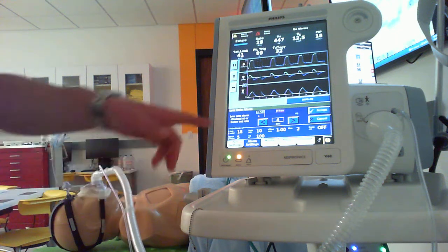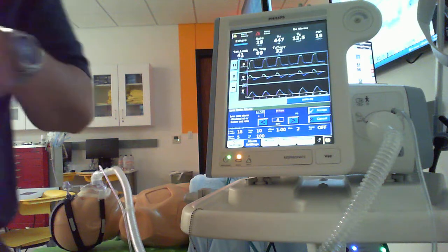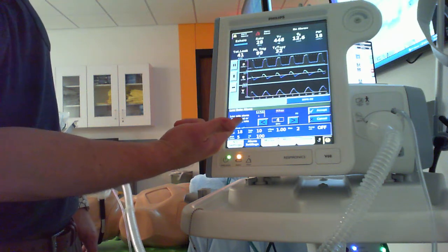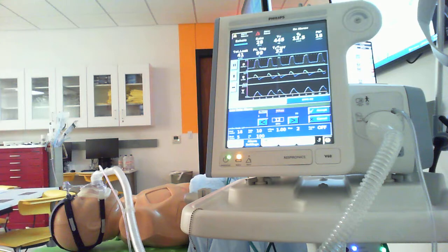Now, keep in mind, we do have a set respiratory rate. So if this patient doesn't take a breath for 6 seconds, okay, it's going to kick in and start giving them timed breaths, so the respiratory rate will never drop below what we have set. So it tells you low rate alarm is disabled below set rate. You can set this at 12 or 14 or something like that.